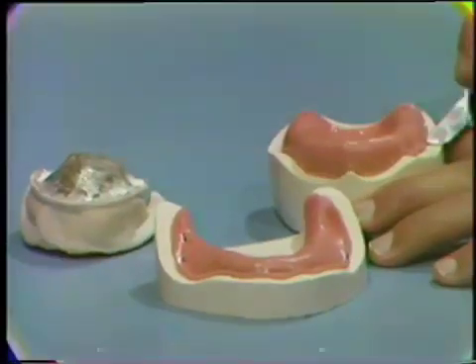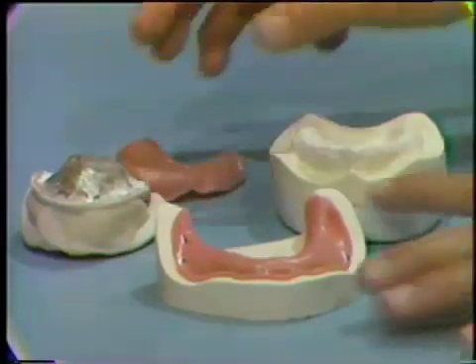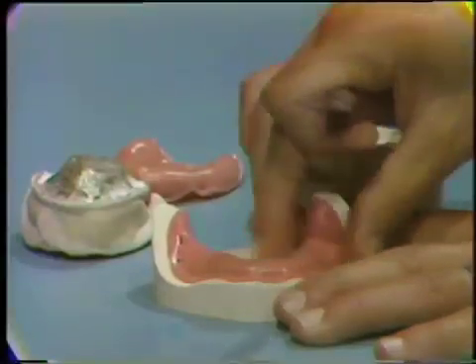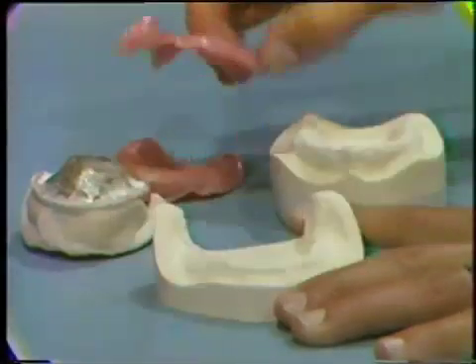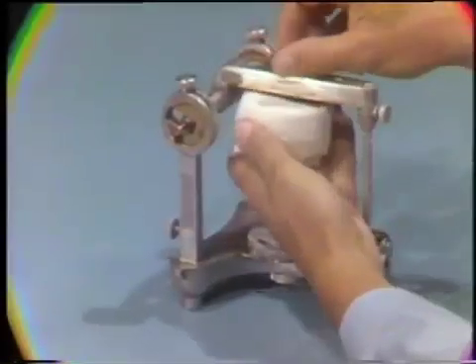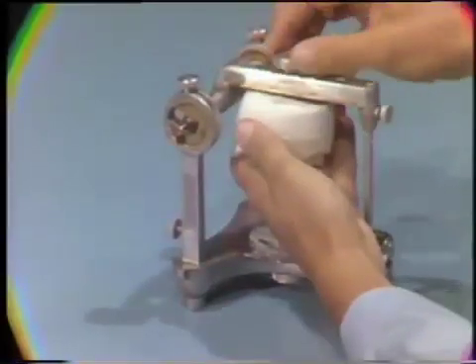First, remove the vinyl base plates. Then place the already mounted maxillary master cast and ring on the articulator.